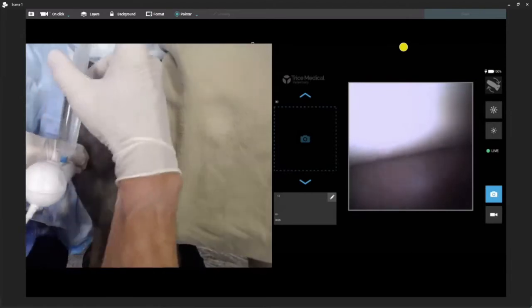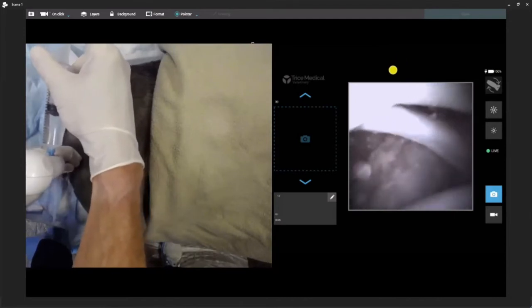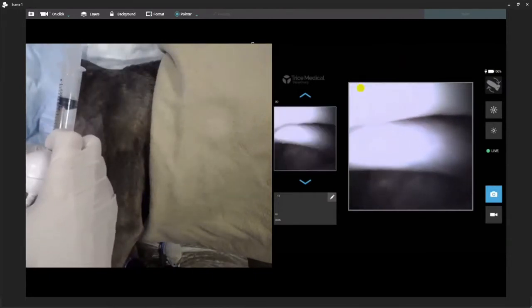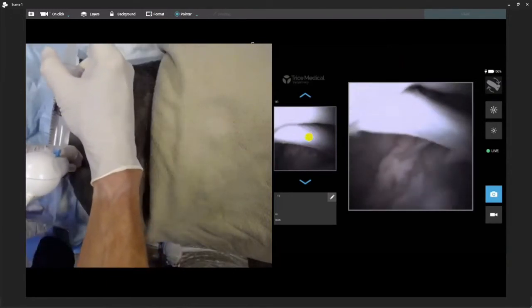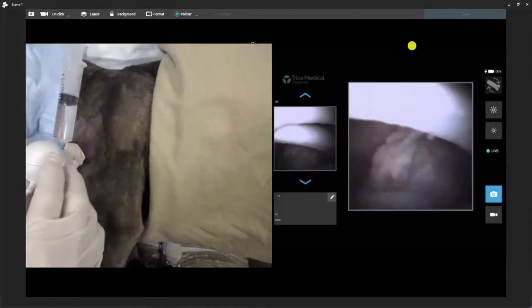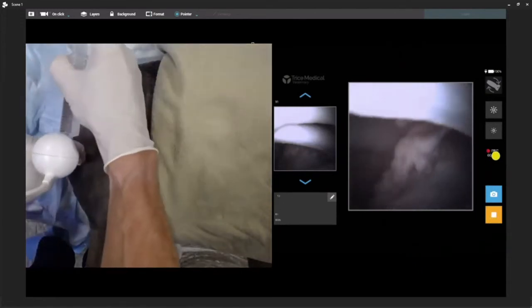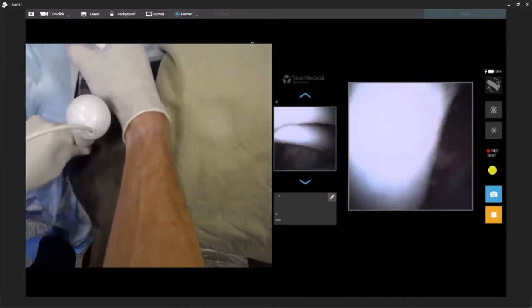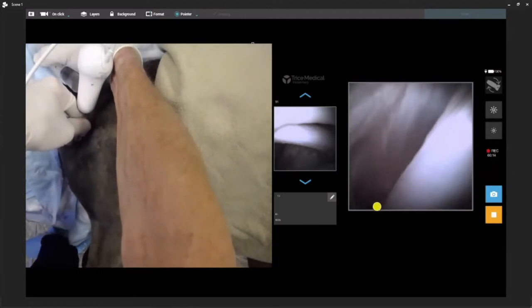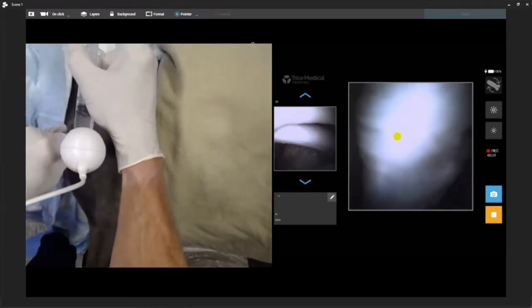We have the leg in a normal standing position. I'm going to add a little bit of fluid, and now you're going to see we're basically in a typical view of the medial compartment. I can go ahead and take pictures — there's a little button that I'm going to depress, and that will obtain a still image. Now I'm going to drive along. You can see where we have the point of origin of our biceps tendon very nicely. We can get still images for the record, for the client, for the referring veterinarian.